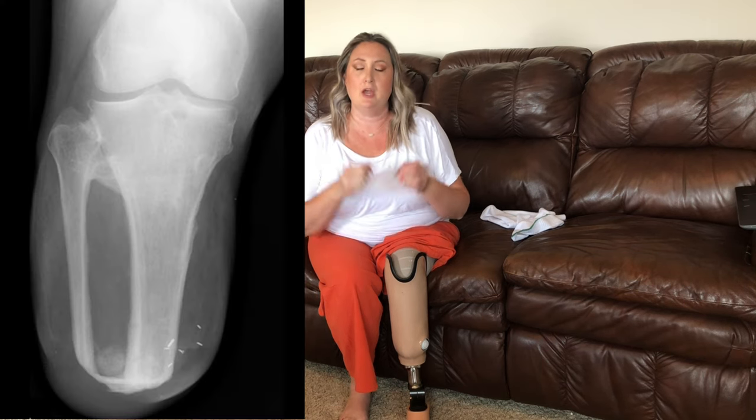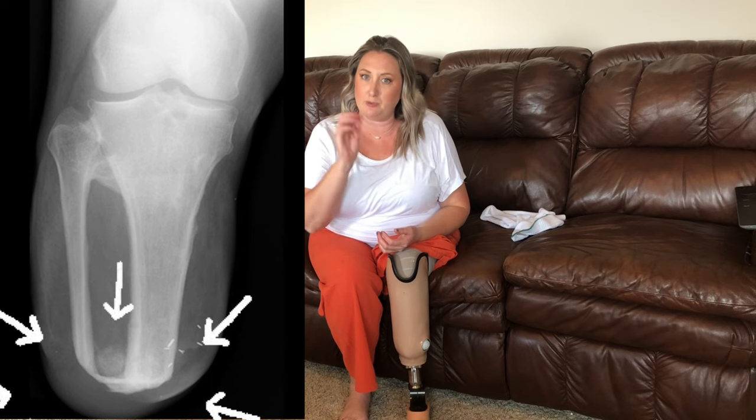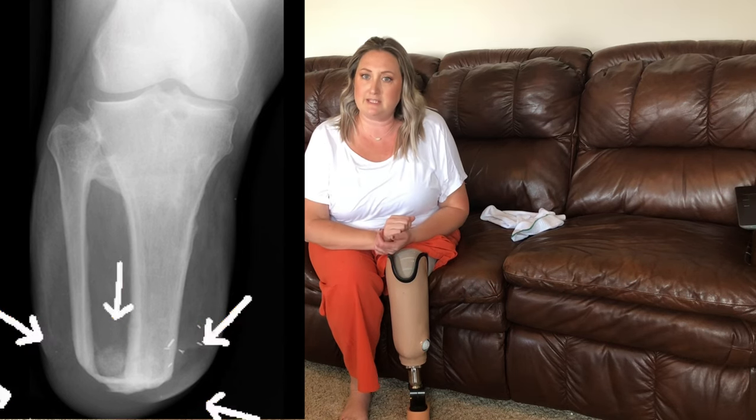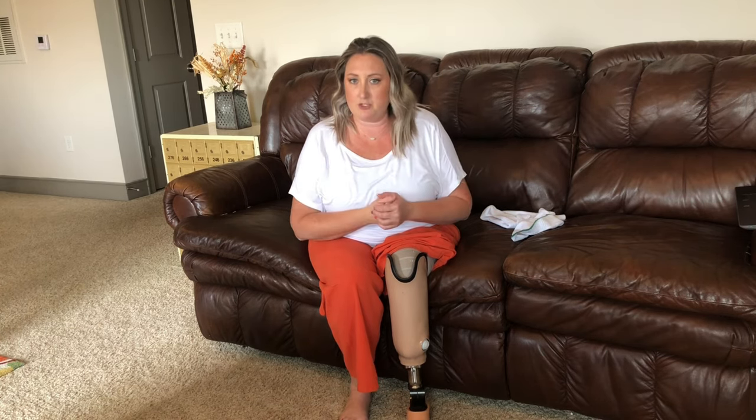My residual limb is actually not end bearing at all, even though I've had an Ertl procedure. The Ertl procedure is a bone bridge connecting the two bones in your leg — he puts bone tissue there and waits for it to heal. A lot of amputees love it; some don't want it because it's a longer healing period. That is completely up to you and your surgeons. Even though I have that bone bridge, I am not end bearing, meaning I cannot bear weight on the end of my residual limb — it is incredibly painful.